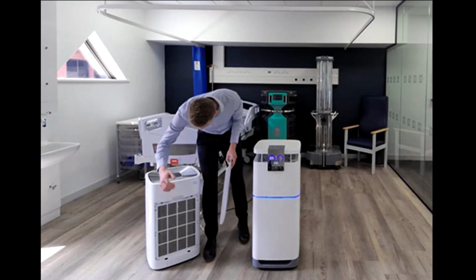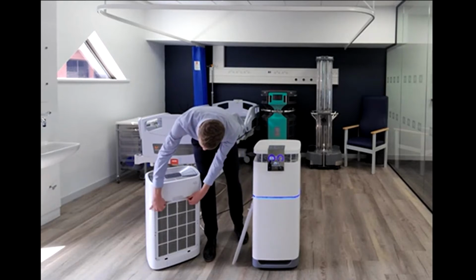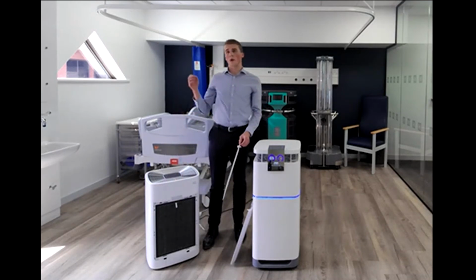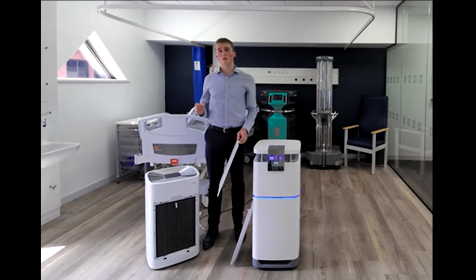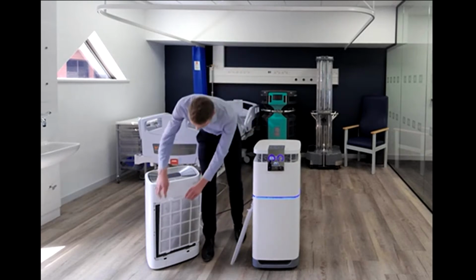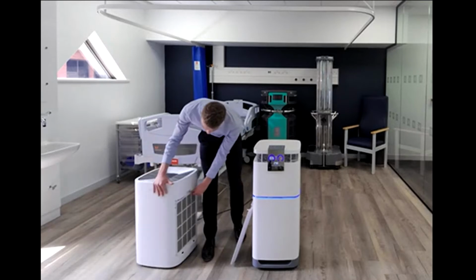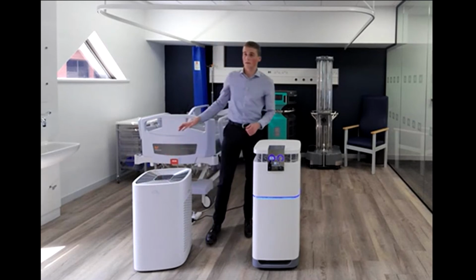Before it then goes behind that, we have the HEPA and carbon filtration, which is a combined module, which is removing the finer particles in that room. So we know that we've got H13 filtration, and that's removing the particles in that area. And then there's also incorporated in that is the carbon filtration. So that's removing the odours, any smells in that area, before it then passes through an ionisation module and is then discharged back into the clinical area. So that's a very brief overview of the system here.